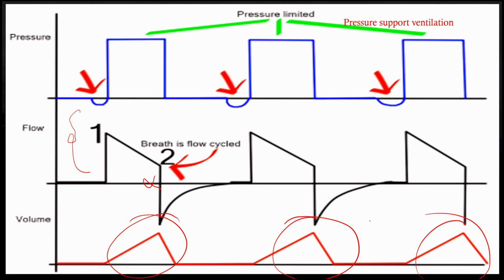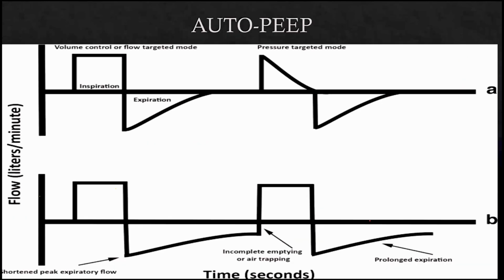So, as I said, it is possible to detect the different modes of ventilation by looking at the volume and flow scalar. And if you add the pressure scalar onto that, you don't even have to read the setting on the ventilator. It's often possible to pick up the mode of ventilation, which is the first step of looking at the graphic, if you remember the 6 steps that I showed you in the 3rd or 4th slide of my talk.